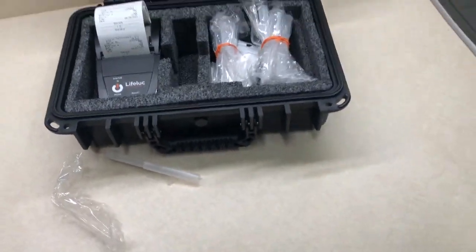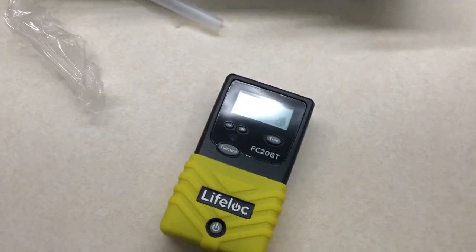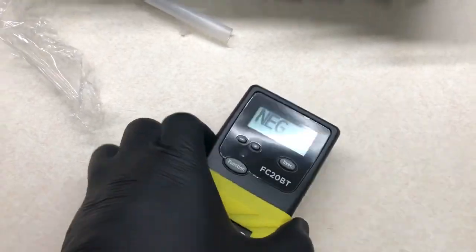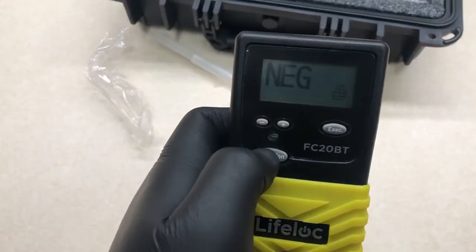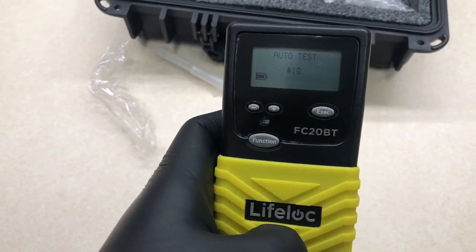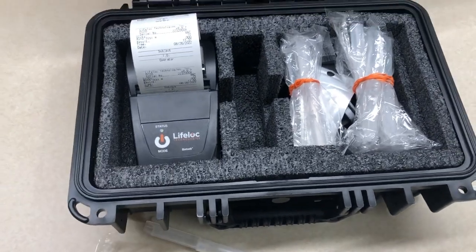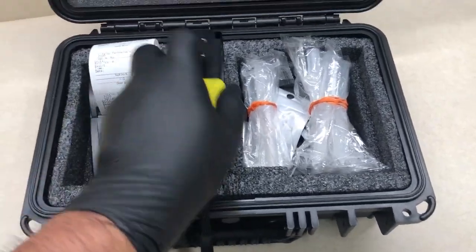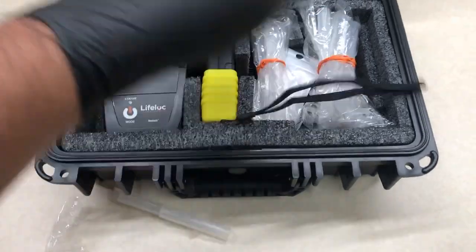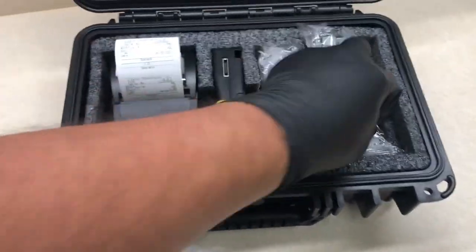And if you guys have any questions, that was a quick overview on how to use this Lifeloc FC20 Bluetooth. So we're just going to hit menu, go back, and then power it off. Whenever you put this away, make sure you power the printer off as well. Put this bad boy back in there. Tear off the paper if the doctors need it, or if we need to put it on anything.